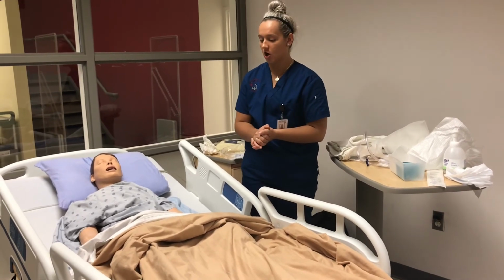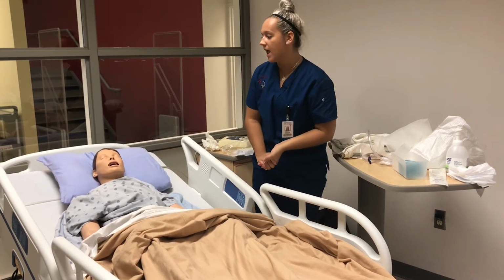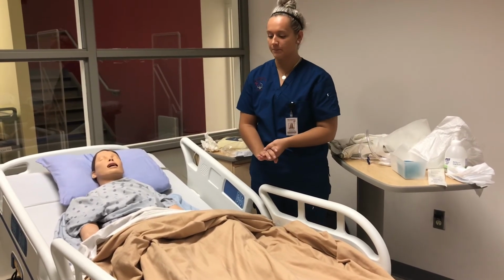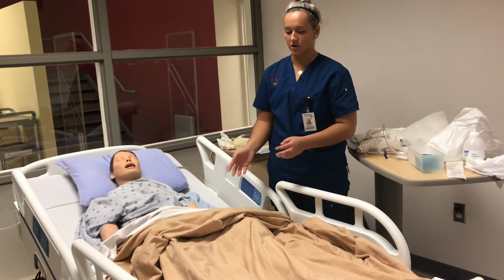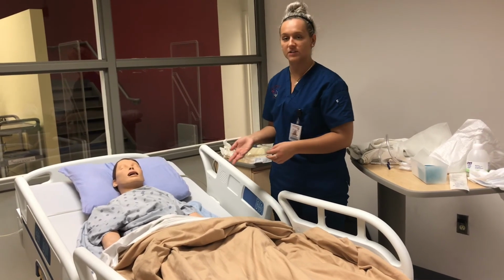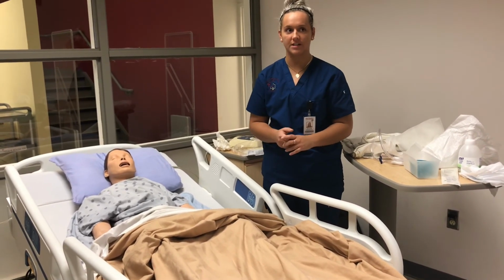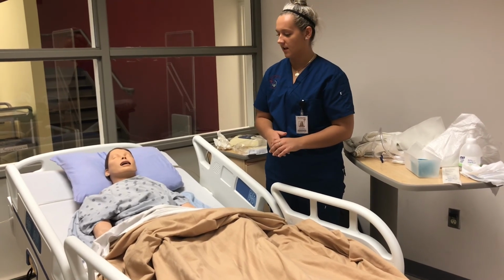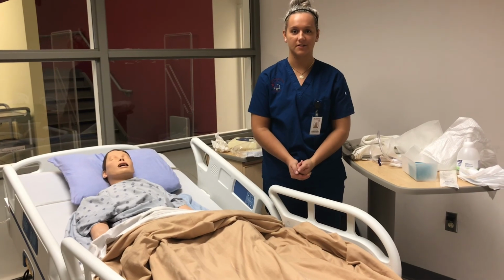And it's important to document everything, all of your findings during the procedure, and to take note of Mr. Mancini and his urinary output, asking him if he feels pain at any time to let us know, and that it might be painful the first couple times he voids, and if he feels any pain, it's important for us to know about it.